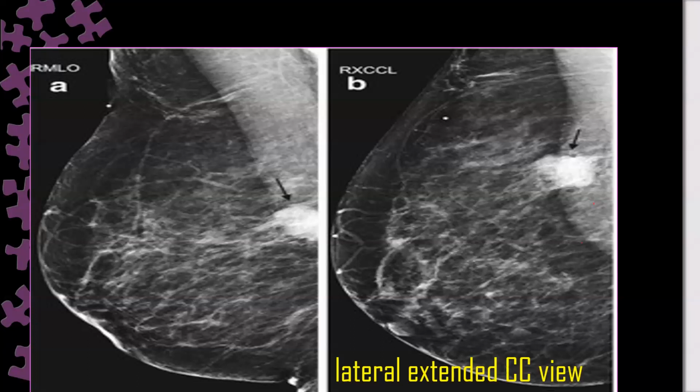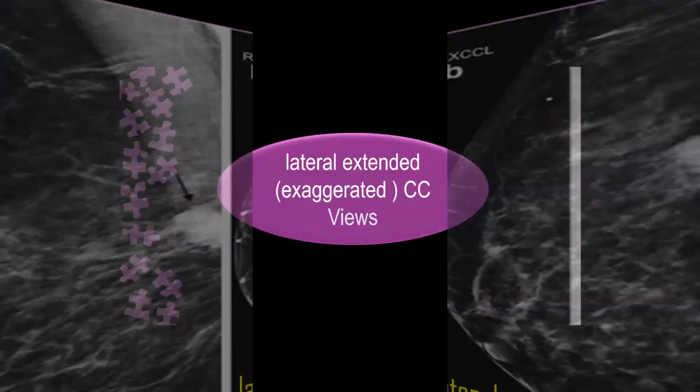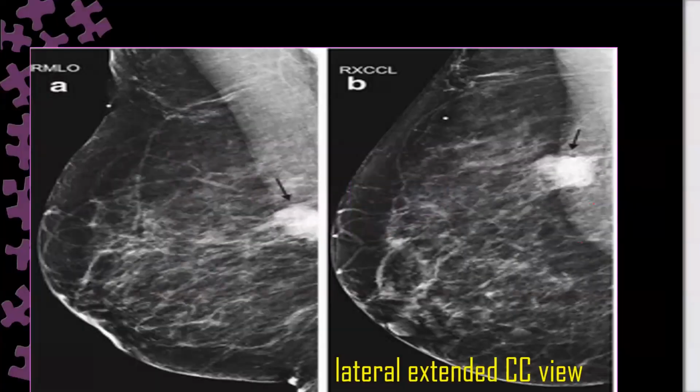When you do a straight lateral, half of this tissue will be cut away. The extreme posterior will be cut. It will not be included. That is why they select the obliquity. They select the oblique to rest along the axis of the pectoralis to visualize this deep posterior portion. But it is very unlikely to do a lateral view to visualize more deep tissue than the oblique view. You got the point? Okay, clear.